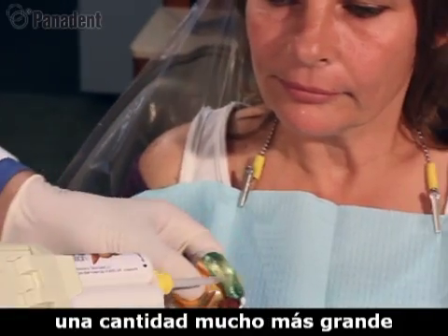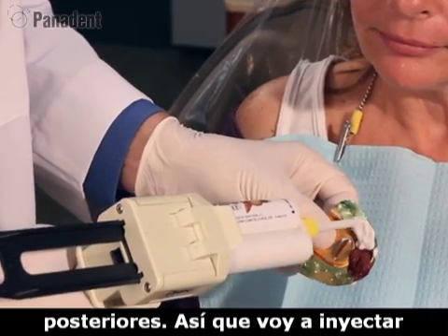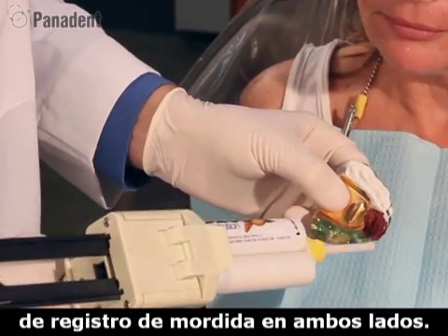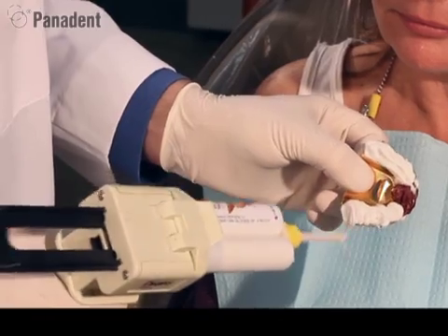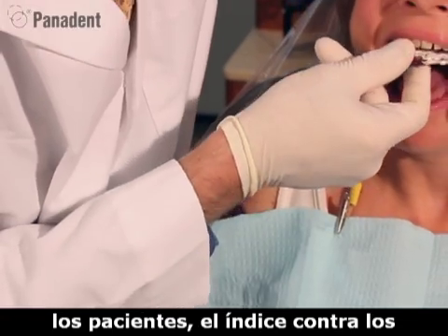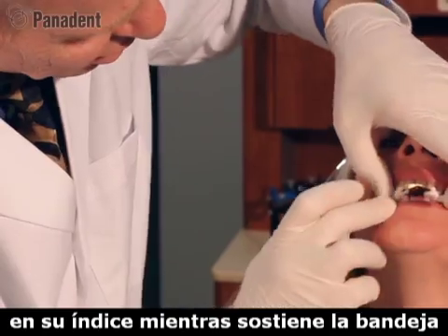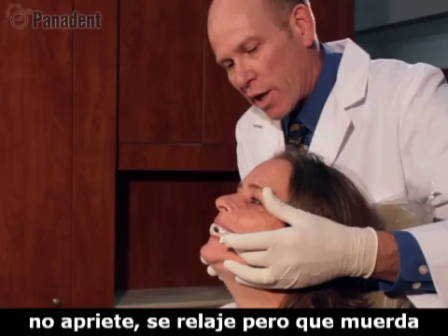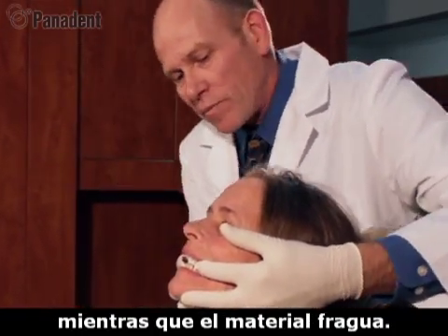Now we're going to inject a much larger amount on the posterior area because we do have that space between the posterior teeth. So I'm going to inject a much larger quantity of bite registration material onto both sides. And go back into the patient's mouth. Index against the upper teeth, have them bite into their index, bite back. They bite into that index while I hold the tray up, making sure they don't clench, relax, but bite up in there. And we'll hold that in place while the material sets.